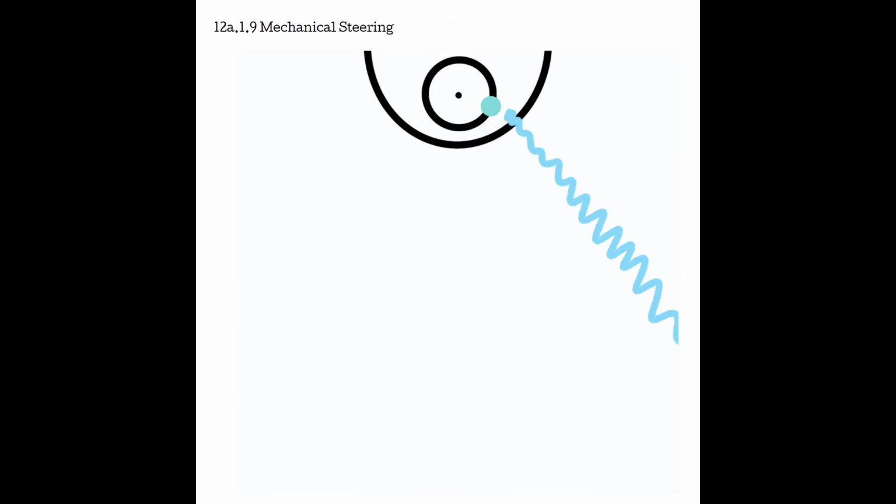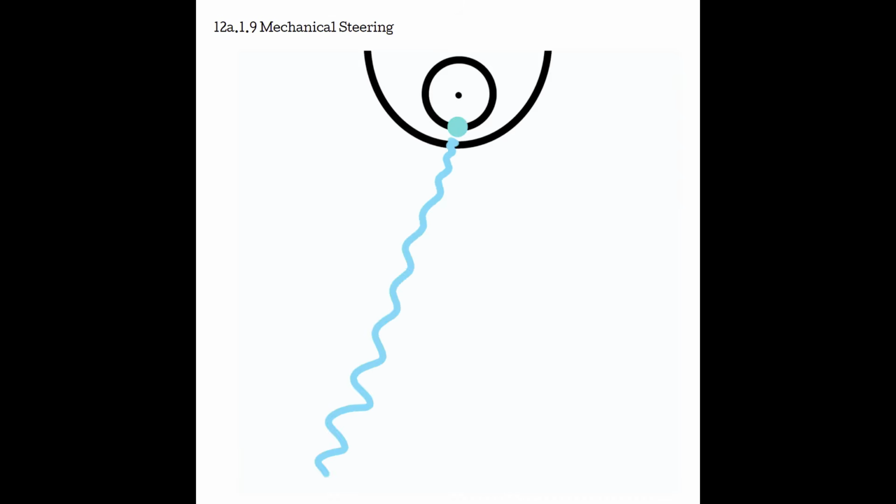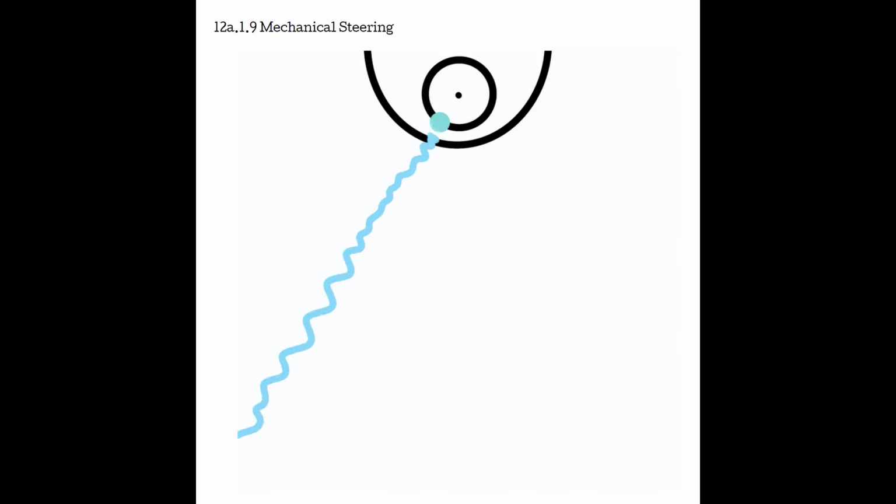Now, the problem with mechanical steering is that these types of transducers, because they have a motor in them, require oil to keep the motor working, very fragile electronics to keep everything working, and it's actually kind of enveloped in this large, fluid, oily, greasy coupling fluid inside the transducer, which actually leaked out quite a bit and would come with kits where you could inject more oil into the transducer. So they worked, and they still work, because we do still use some mechanical steering transducers, but they aren't as practical as our modern day transducers.